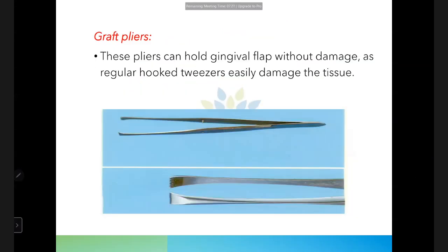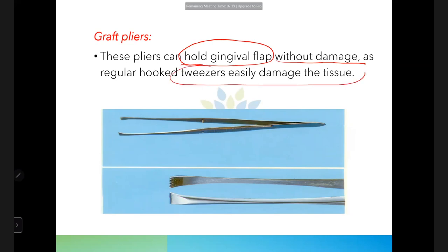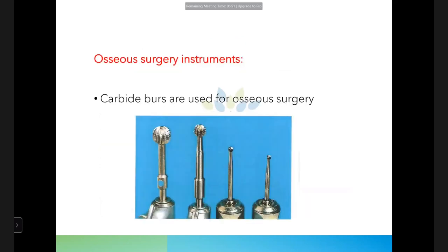Graft pliers are also used to hold the gingival flap without damage. Unlike regular hooked tweezers that easily damage tissue, graft pliers provide a better grip and are more atraumatic, making them preferable for holding flaps.